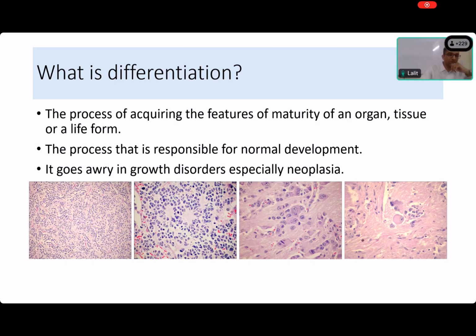Glands also have empty lumens. Yes. You can't see very clearly over here, but the center of this is not empty. It has got a sort of pinkish hue. Oh, yes, ma'am. Okay. So you correctly said it was a rosette.